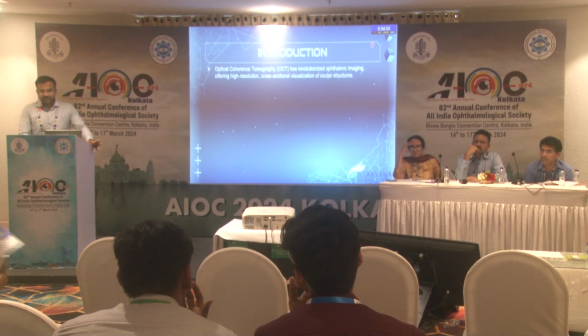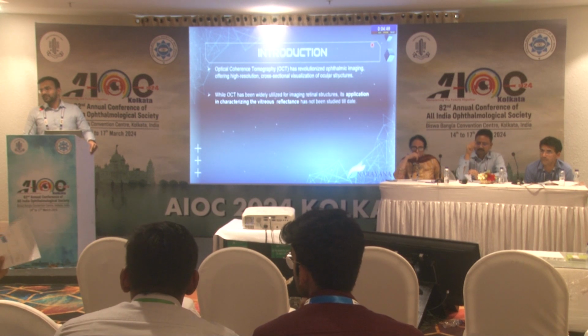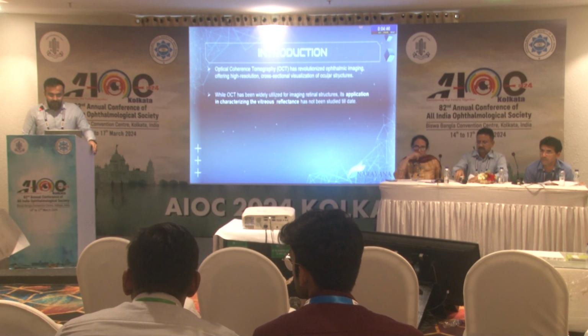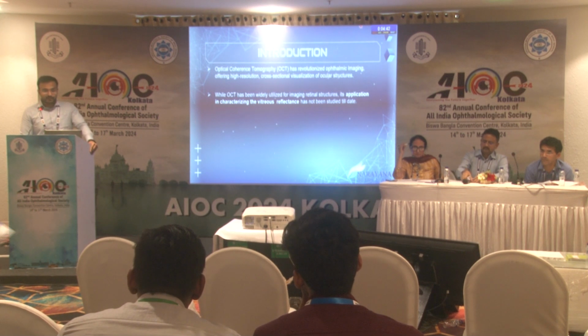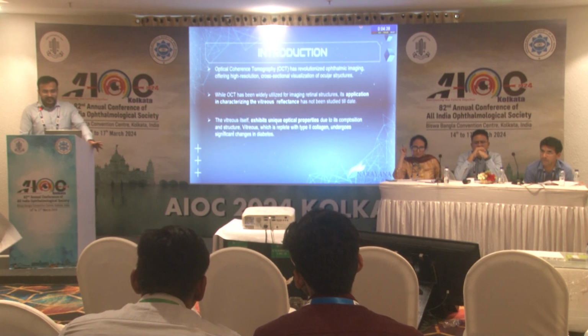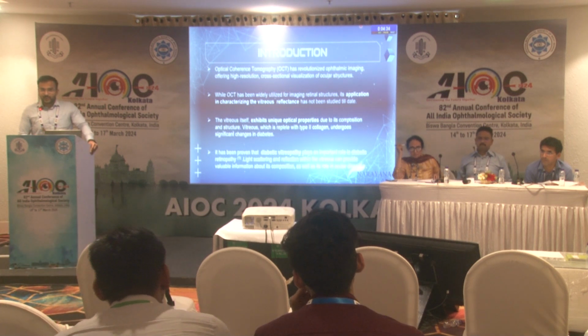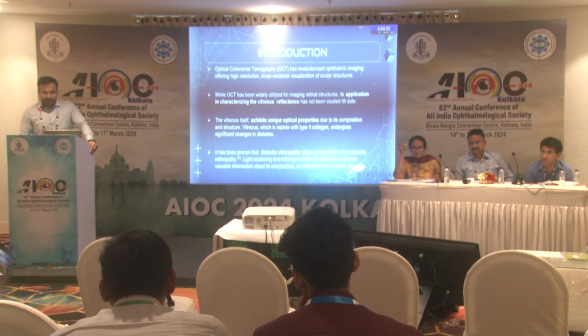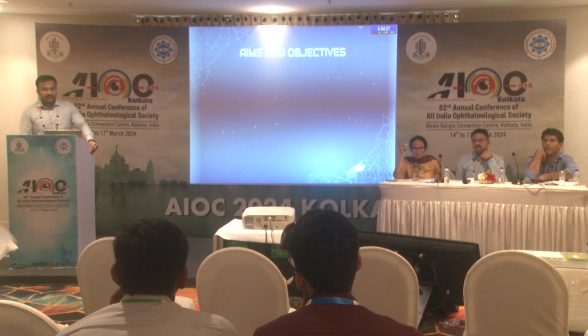OCT has been a part of ophthalmic imaging, offering high resolution cross-sectional images of ocular structure for the past 2 decades. But OCT has still not been used for characterizing the vitreous reflectance. The vitreous itself, as we know, exhibits unique optical properties due to its composition. It has been proven in some papers that diabetic vitreopathy plays an important role in diabetic retinopathy, but it is yet to be studied in detail.